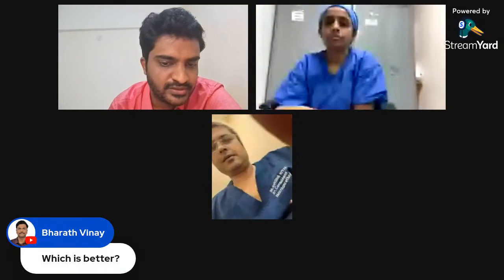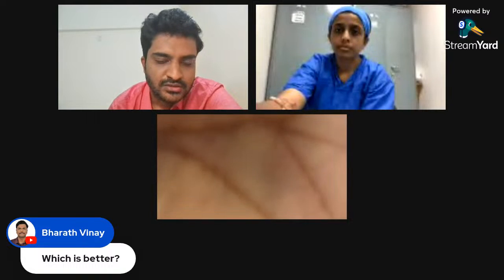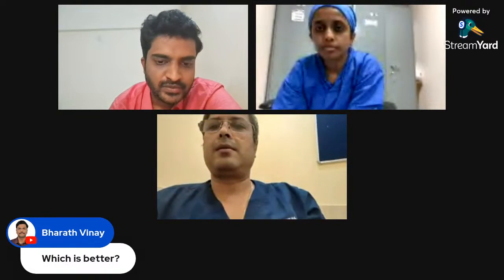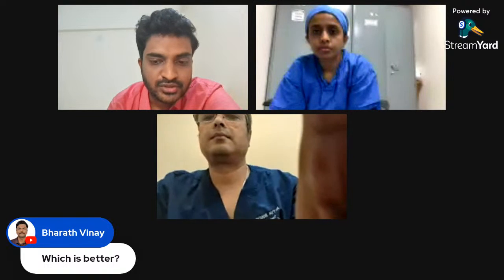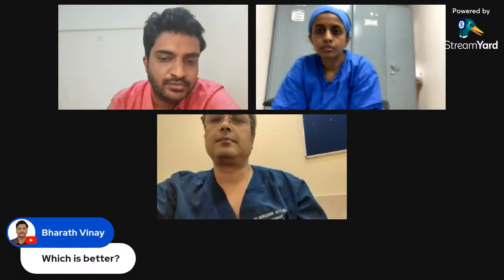See what you're using the TCD and TCCD for. If it solves your purpose, well and good. That's the best modality to start off with. There are drawbacks of TCD and there are drawbacks of TCCD as well. TCD is more of, you presume that your angle of inclination is less than 30 degrees and you use it to insonate most of the vessels. And sometimes you don't know whether what you have measured is of particular interest for you or not. You presume that that is the one.